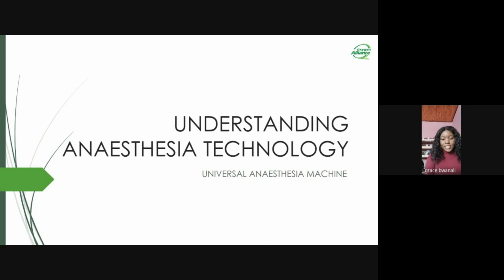As already introduced, today we are going to focus on the Universal Anesthesia Machine. Just a recap: an anesthesia machine is a machine that supplies a mixture of oxygen, gas, and anesthetic agent to a patient, allowing them to remain unconscious but breathing during surgery. The device delivers oxygen while simultaneously ensuring that the patient does not inhale the exhaled, life-threatening carbon dioxide.